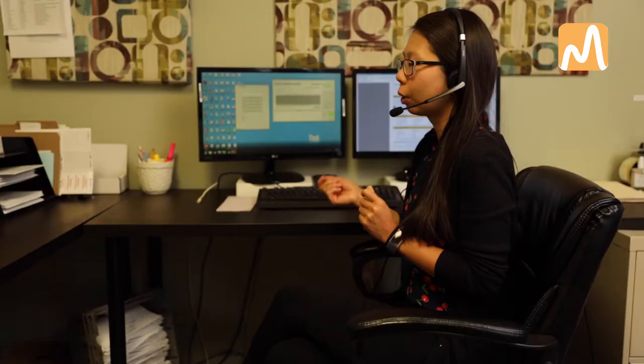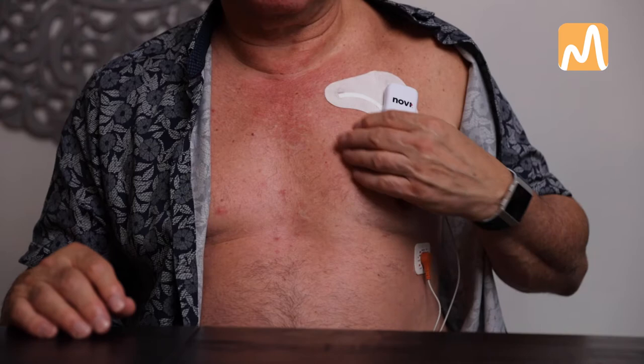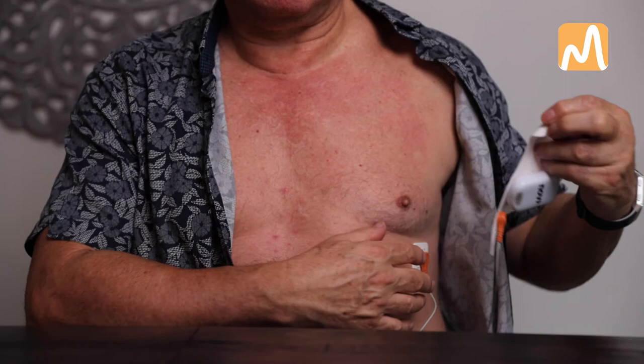Removal and return. The day before the end of your testing period, you will receive a reminder call from the team at M Health Solutions. To remove the patch and device, gently pull off the patch and electrode. You do not need to remove the device from the patch, nor remove the electrode from the lead wire.